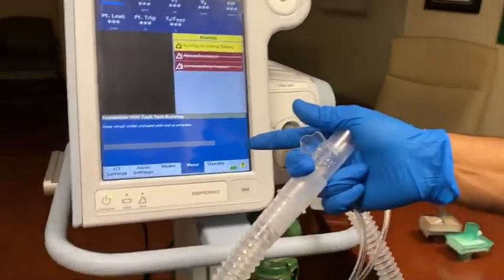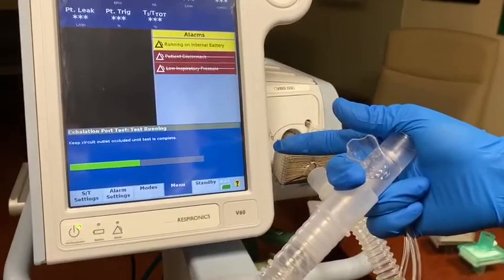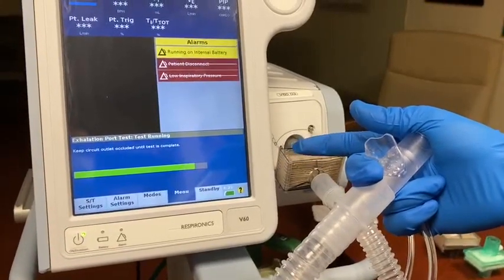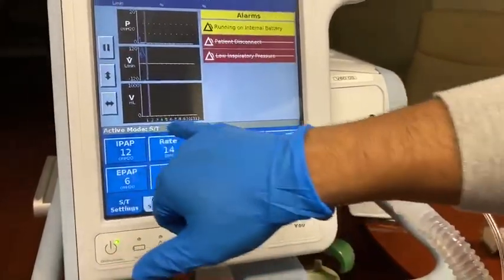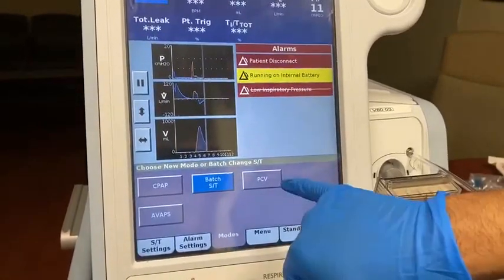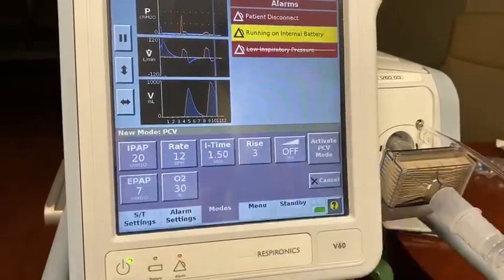Start. Test passed. Start ventilation. Now, currently you are in the ST mode, which is our BiPAP or classic BiPAP setting. You go into mode. You have the option to select pressure control or AVAPs. In our case, we'll go with the pressure control mode.